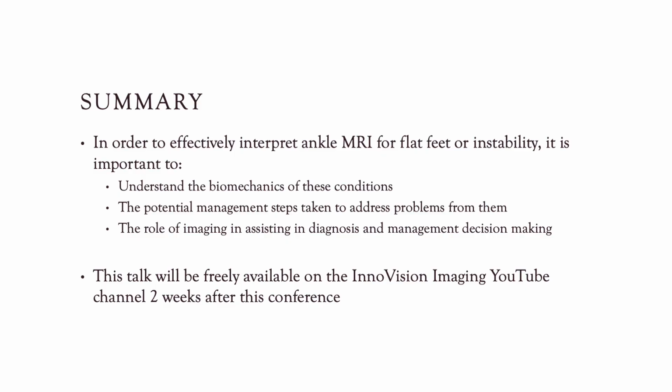So finally, in order to effectively interpret ankle MRI for flat feet or instability, it's important that we understand the biomechanics of these conditions, the potential management steps that are taken to address the problems that arise from them, and the role of imaging in assisting diagnosis and decision making in the management of these conditions.